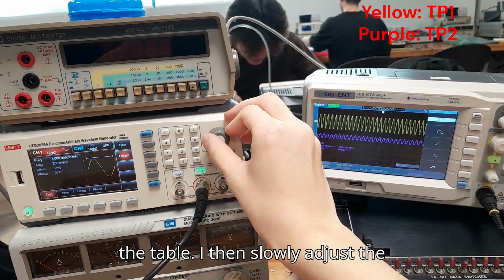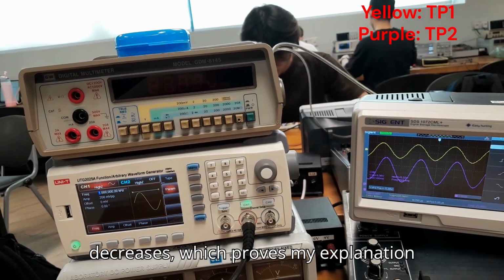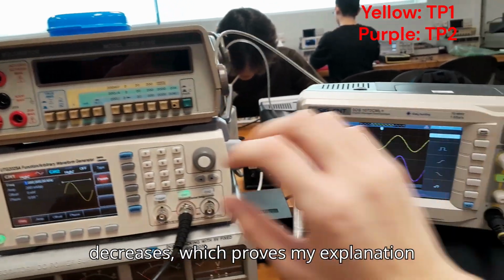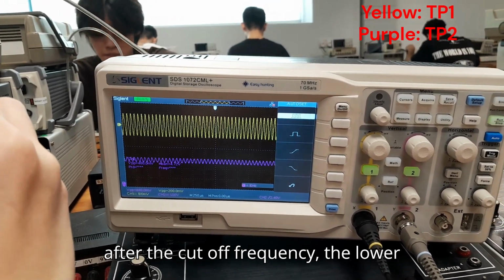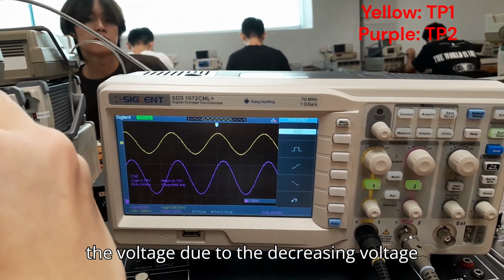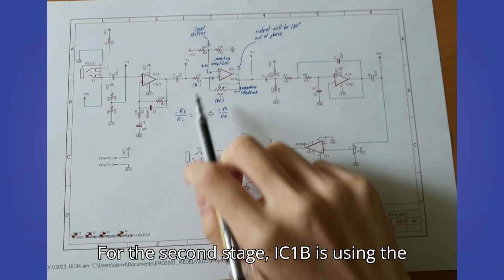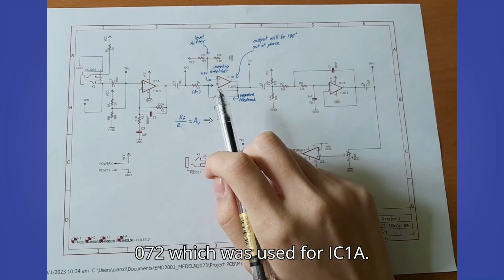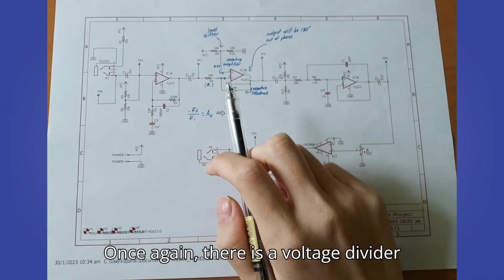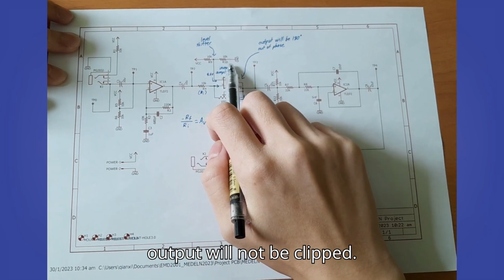I then slowly adjust the frequency, and you can see that the peak-to-peak voltage of the purple graph decreases, which proves my explanation earlier about the higher the frequency after the cutoff frequency, the lower the voltage due to the decreasing voltage gain. For the second stage, IC1B is using the second op-amp from the same IC, TL072, which was used for IC1A. Once again, there is a voltage divider which acts as a level shifter so that the output will not be clipped.